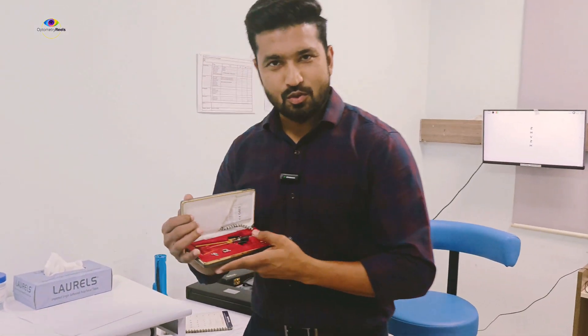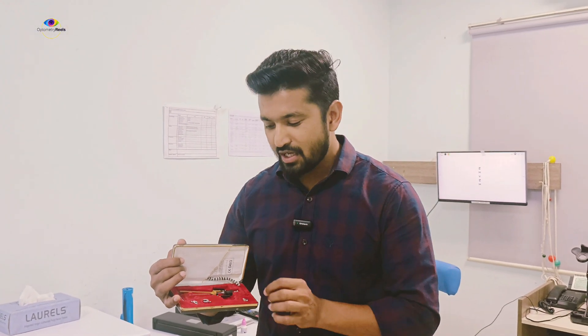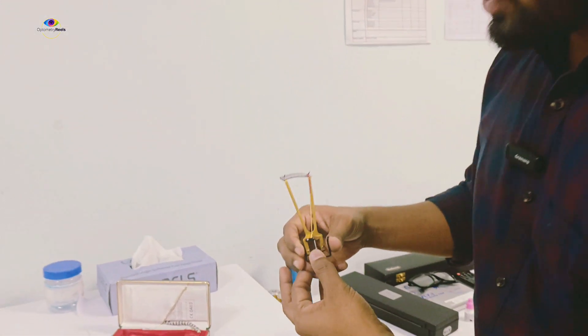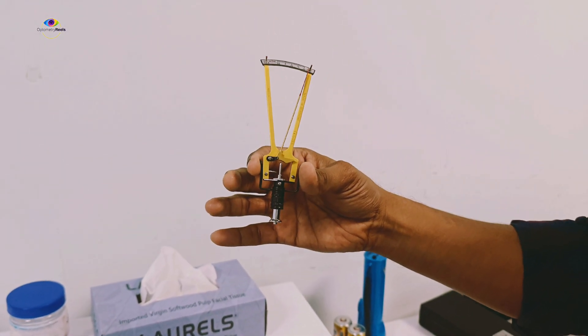Hello and welcome to OptoMaterials. Today we are going to discuss something very important — we are going to learn this instrument which is known as Schiotz Tonometer. This Schiotz Tonometer is used to perform tonometry to measure the intraocular pressure. It is low cost, highly useful, and can be carried anywhere — it is very handy and portable.